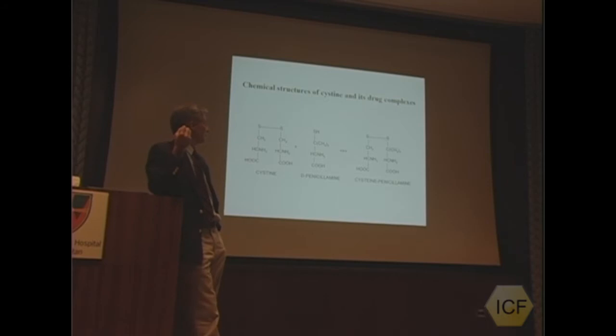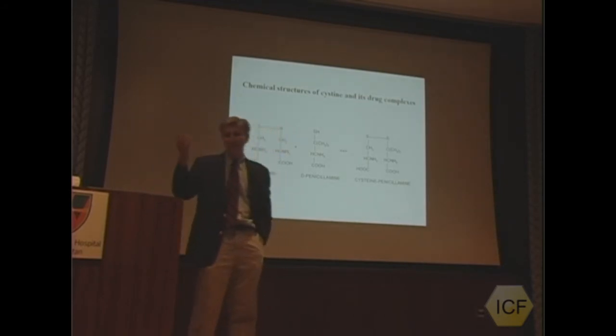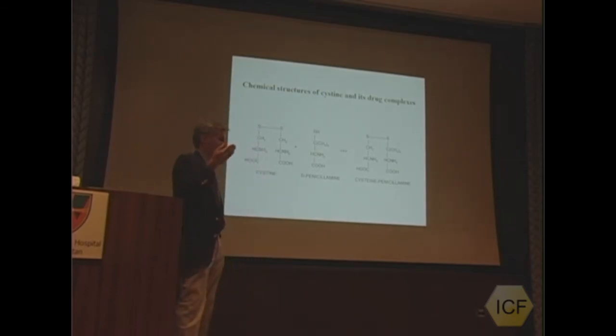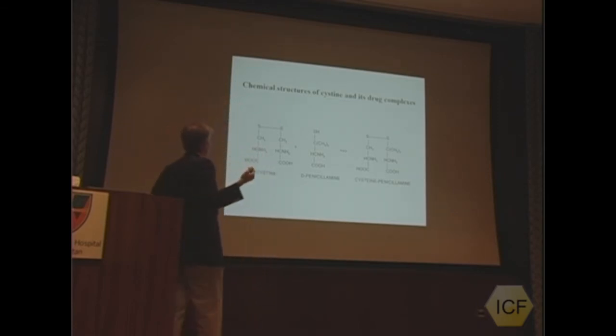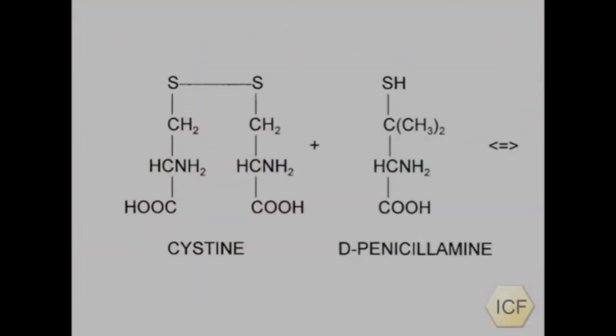What you get when you're on the drug, the knowledge that you have about your urine chemistries when you're being treated with the drug, depends on how the cystine is measured. Cystine can be measured by a variety of ways. It can be measured by liquid chromatography. It can be measured by gas chromatography. A simple and still commonly used method is an old chemical method, a so-called colorimetric method, in which the sulfur bond is broken, and basically you measure the amount of sulfur reactivity in the urine.